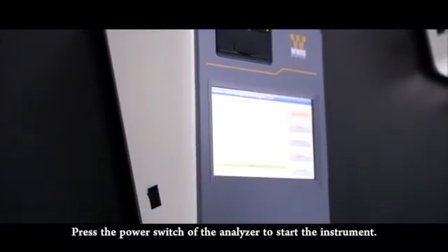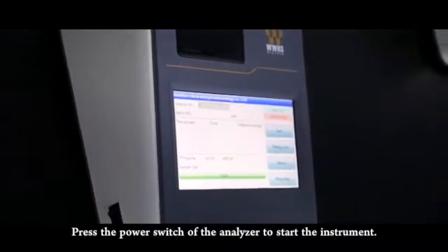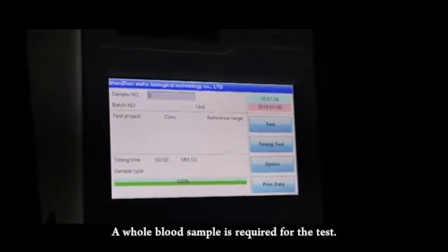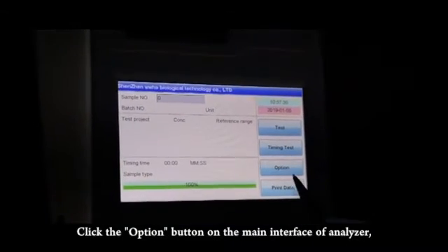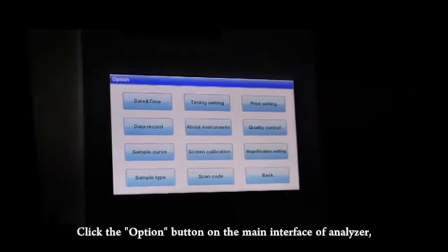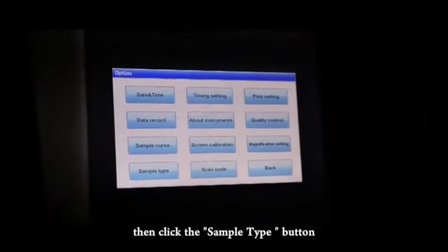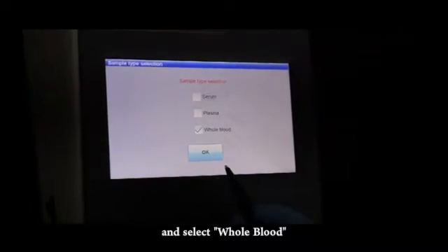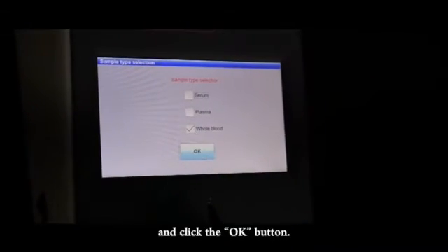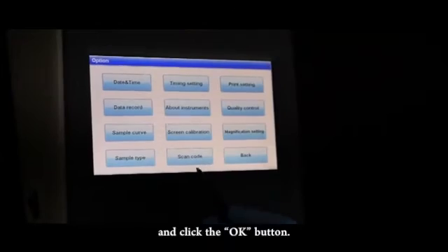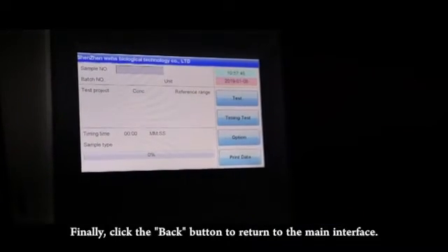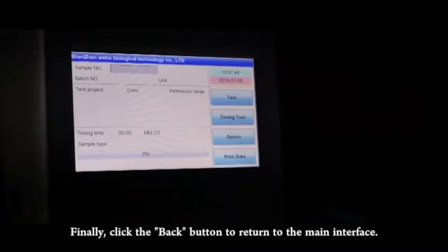Press the power switch of the analyzer to start the instrument. A whole blood sample is required for the test. Click the option button on the main interface of analyzer. Then click the sample type button and select whole blood and click the OK button. Finally, click the back button to return to the main interface.